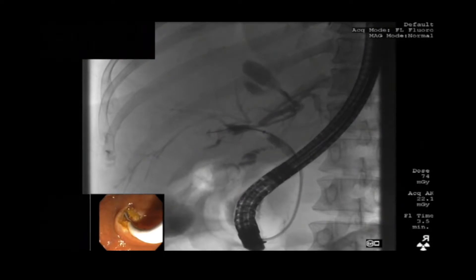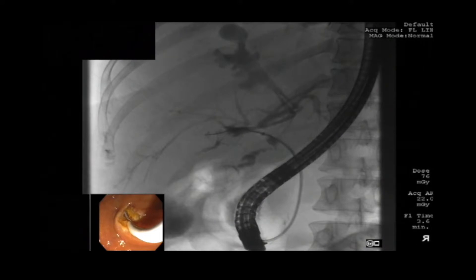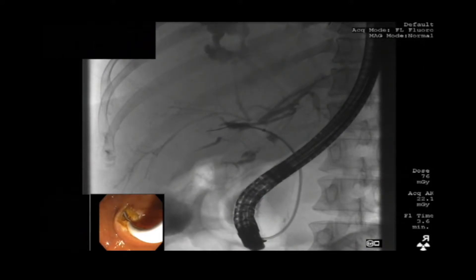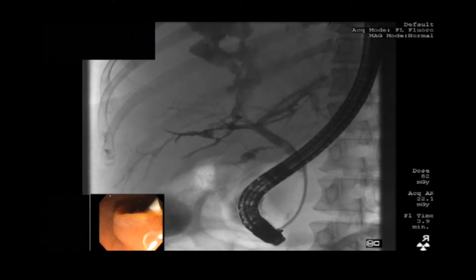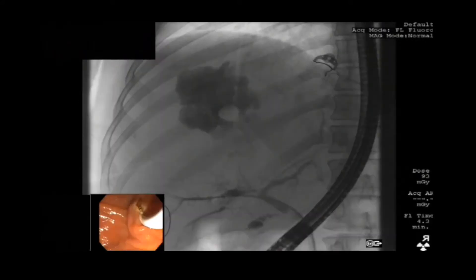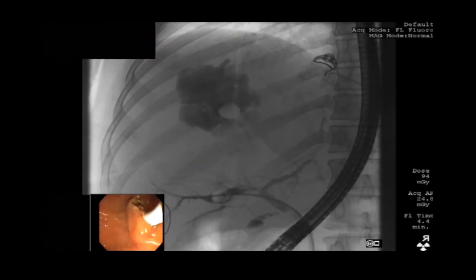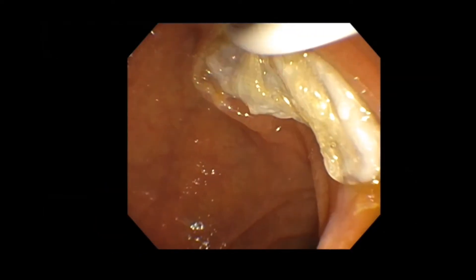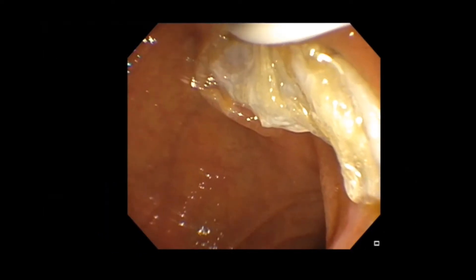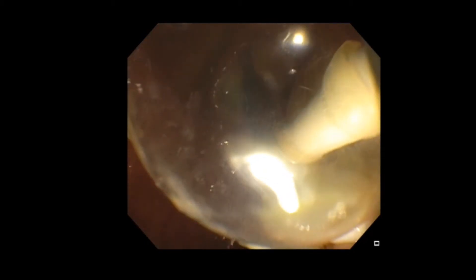The duodenoscope was advanced to the second portion of the duodenum. Bile duct cannulation was performed, and occlusion cholangiogram showed contrast dye extravasating from the left and right hepatic ducts into the echinococcal cyst. Biliary endoscopic sphincterotomy, followed by sweeps of the extraction balloon catheter, exposed brood capsules and hydatid sand from the common bile duct into the duodenum.